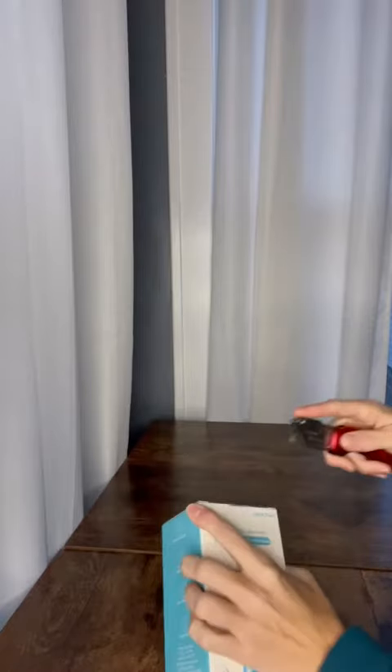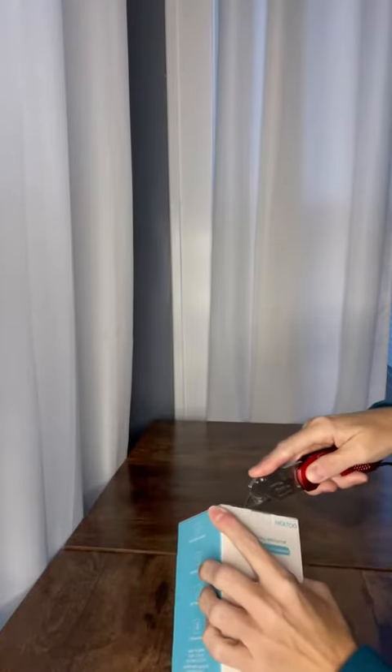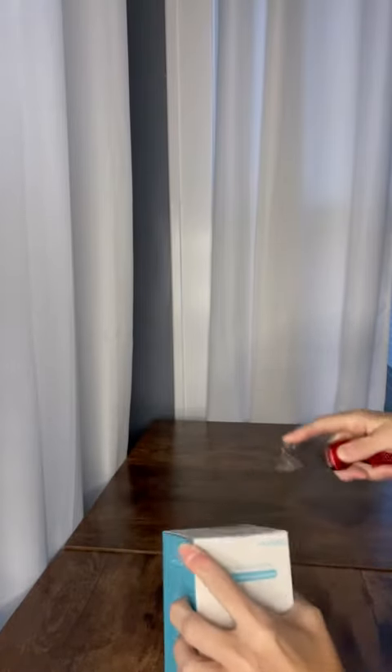Hi guys! So our portable irrigator came in, which is perfect because my son was told by his dentist that's putting on the braces that he needs one of these, so I went ahead and got him one.